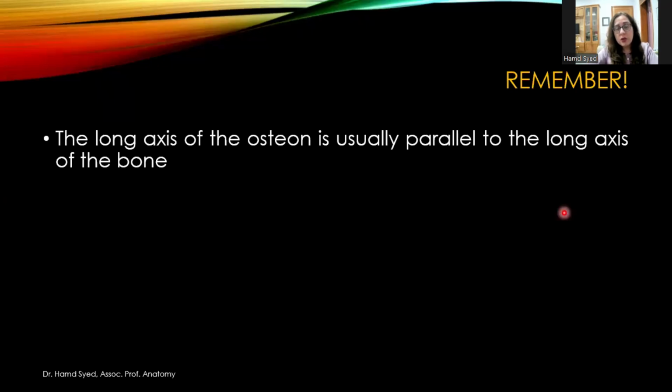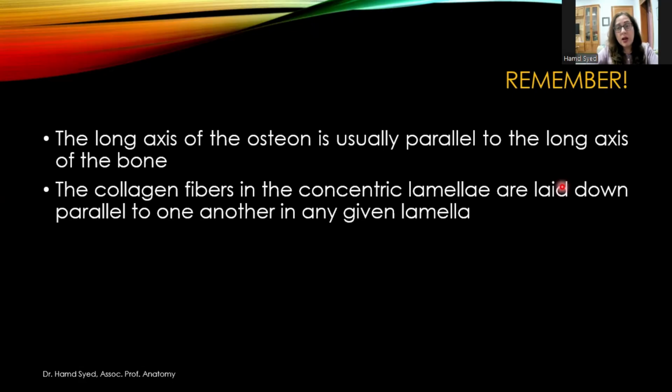The long axis of the osteon is usually parallel to the long axis of the bone. We saw this in the sections, and if you look at the longitudinal sections, then we will understand how the osteon is parallel to the long axis of the bone.